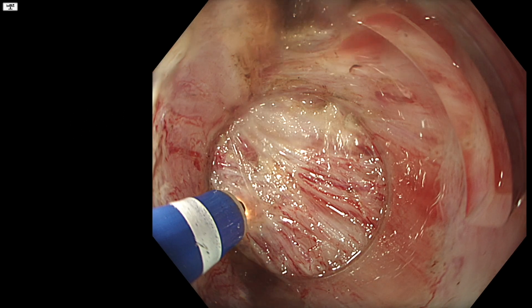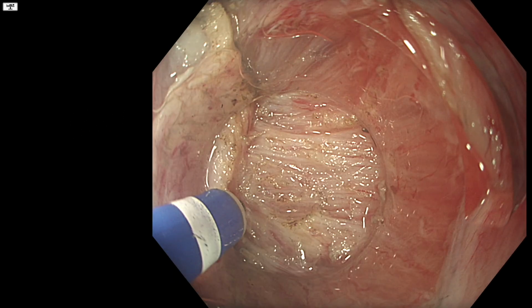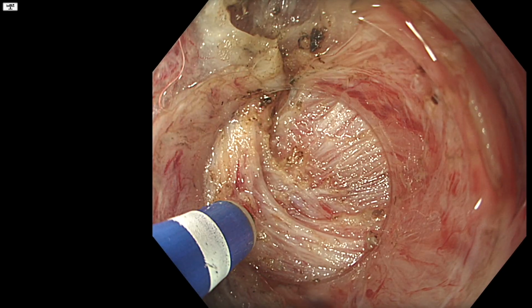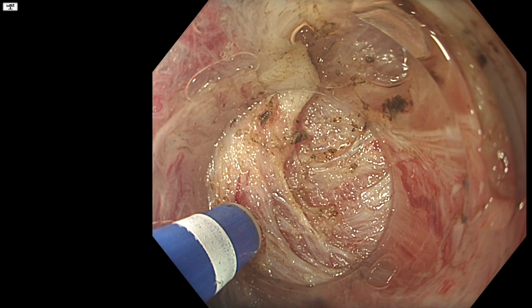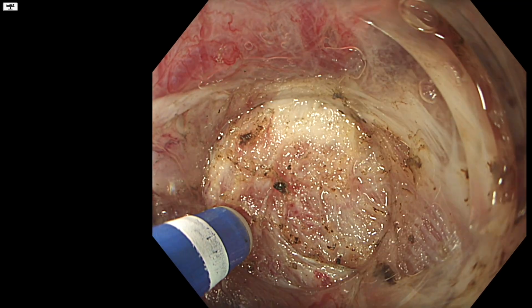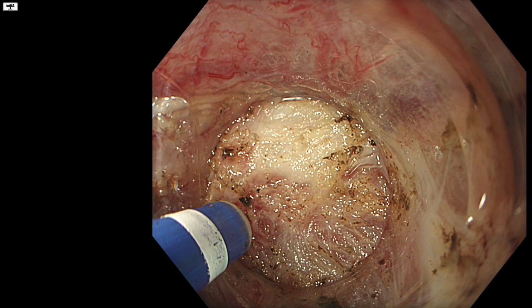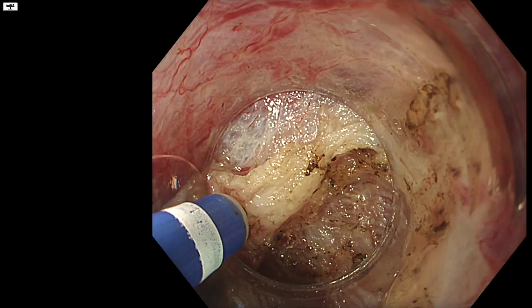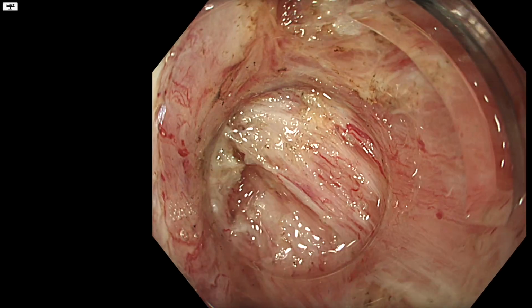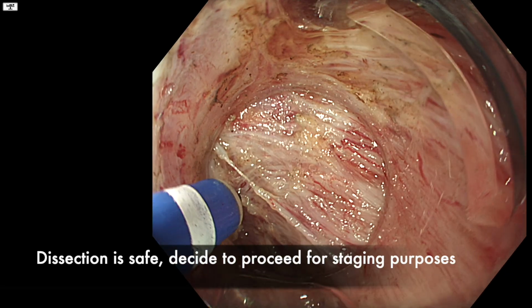Okay, so it's quite obvious now that we've lost the intermuscular plane under the lesion. So this brings us to a critical decision. Do we now stop or do we continue? In this case, my reasoning for continuing was the following. I thought the field is clean, there's no active bleeding, we have adequate time, and we're in a safe anatomical location, which is the lower posterior rectum. And most importantly, completing the resection would give us a specimen with definitive histology and margin assessment, which at the end of the day is the information that the MDT needs to make the right treatment decision. So in the end, I decided to proceed.